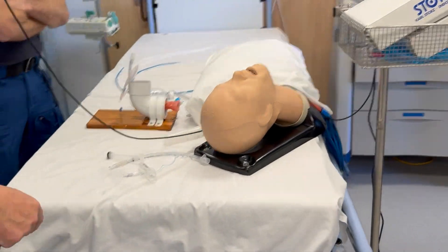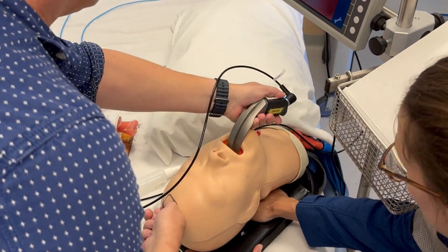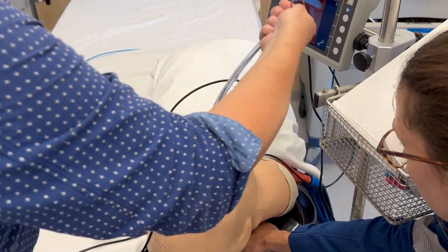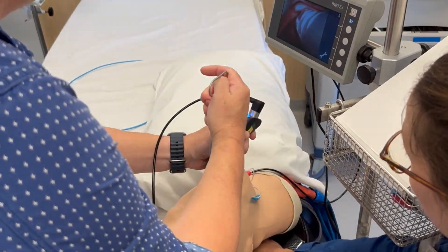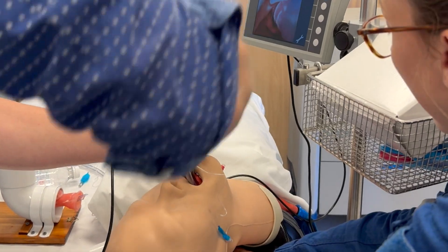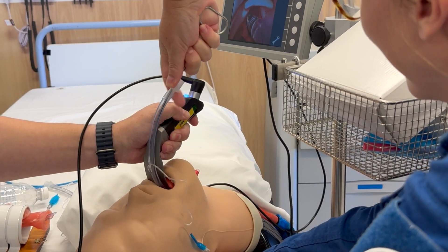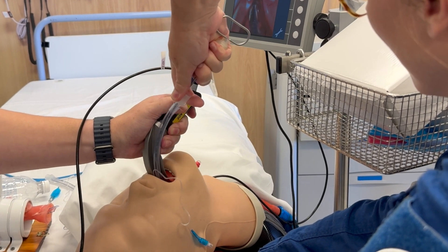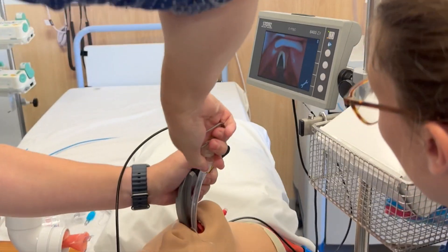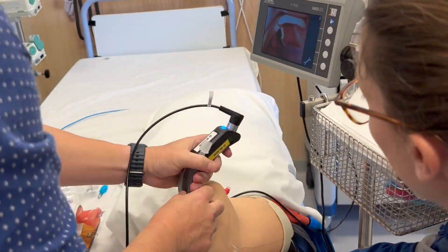Let me just run you through it on the mannequin. Blade in the midline on top of the tongue, rotating until I get a grade two view, lifting to get a grade one view, holding the tube from the top, hugging the blade and following it down into the glottis, docking the tube in the glottis, bringing my hand around, popping the stilette up a bit so you can see the tip, then sliding it off. Advance the tube, inflate the cuff, watch the cuff go up, pull the tube out to depth — CO2 in the green zone. We're done.